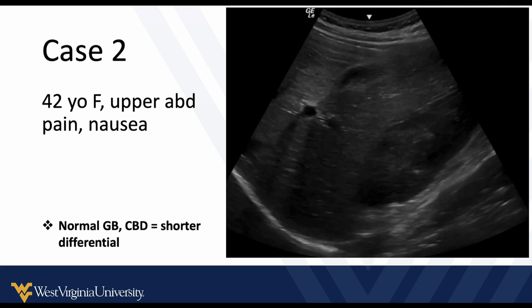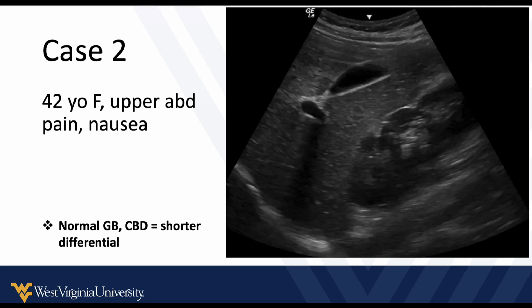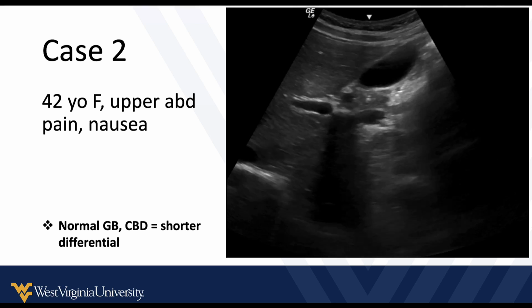So in this patient, you can move to the other things on your differential diagnosis, cross this one off, and start looking forward, treating other things. And that's, again, how that can help you. It just speeds up the time from history and physical to working your differential.